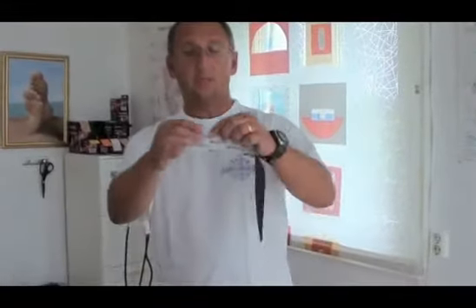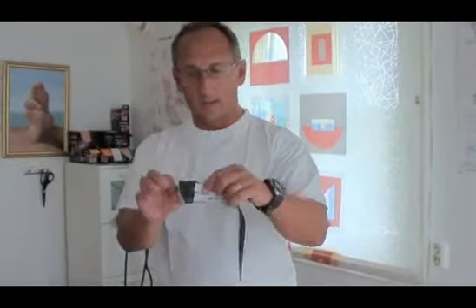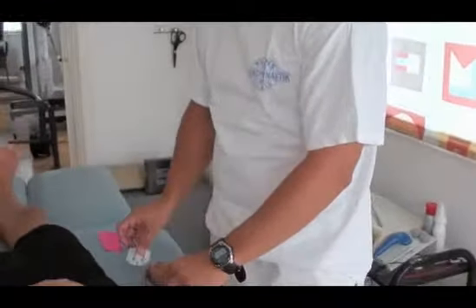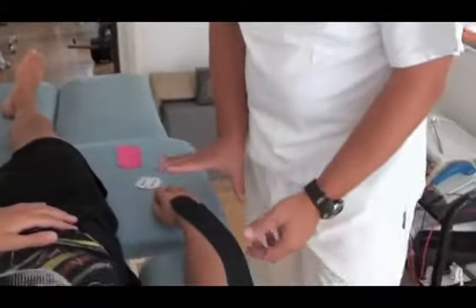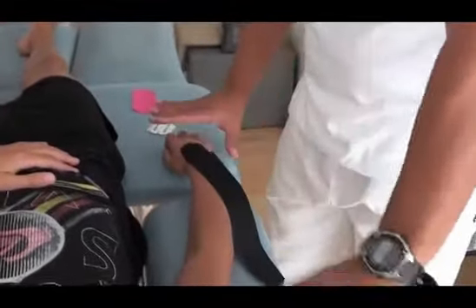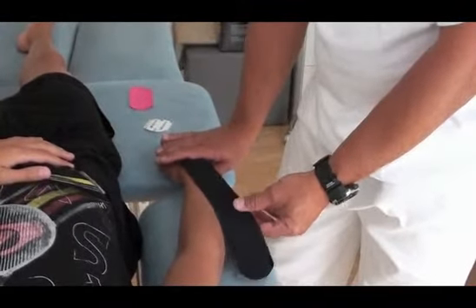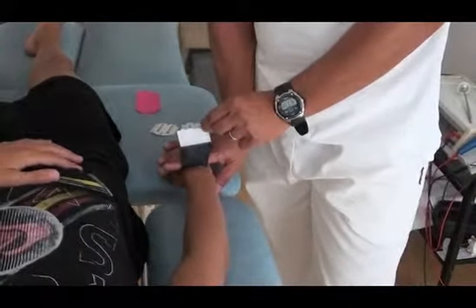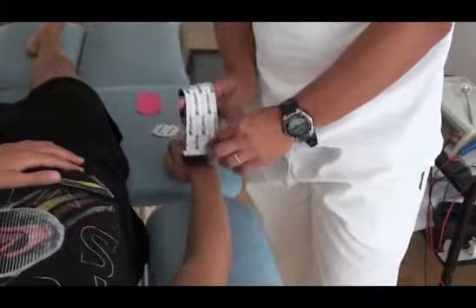What we do is that we crack the tape and pull. When we do that, you can see the paper is coming off. And then we just put it on his wrist, a little bit on his hand. Put it like this, you see that? Now the arm is straight and the wrist is straight too. Now we keep our hand on the tape and we pull. And when we do that, the paper is coming off. This is a quite easy technique and it's very useful.